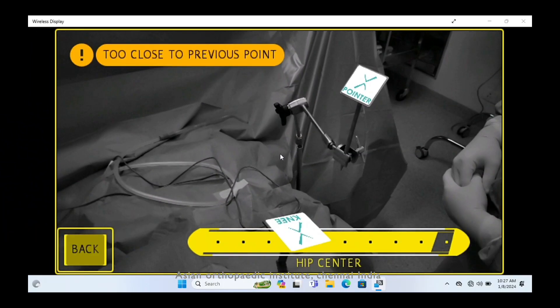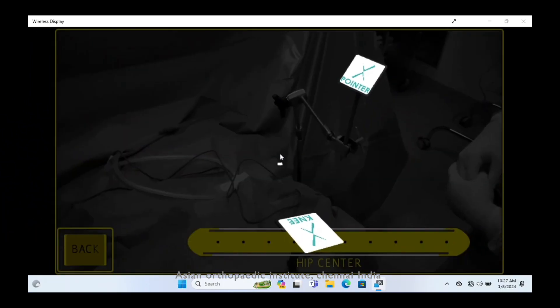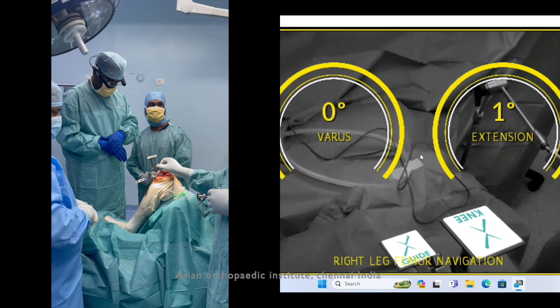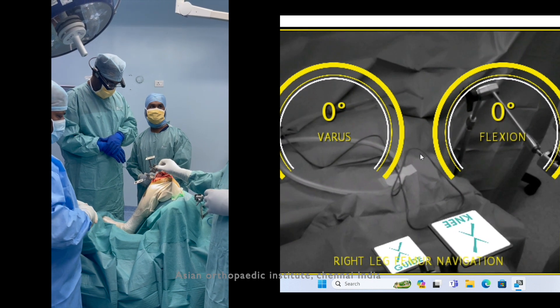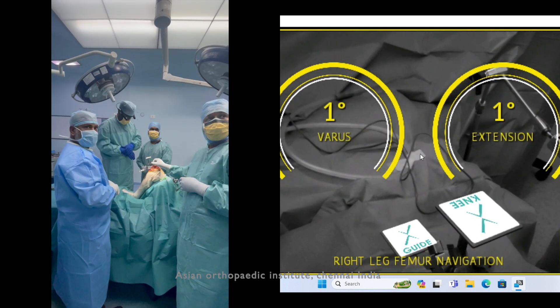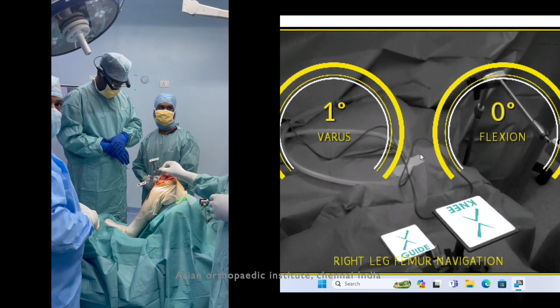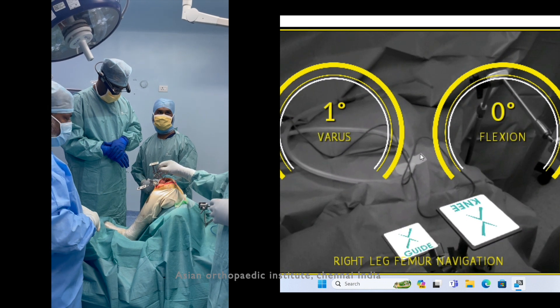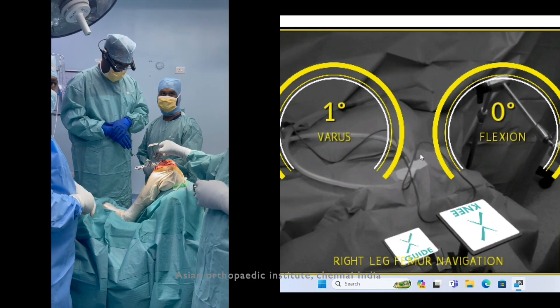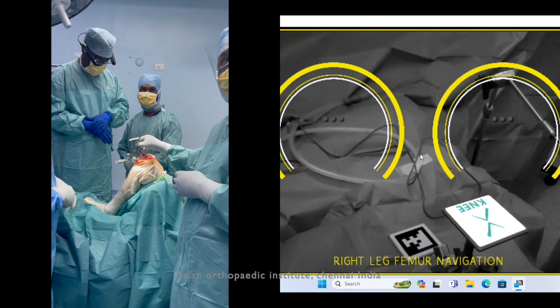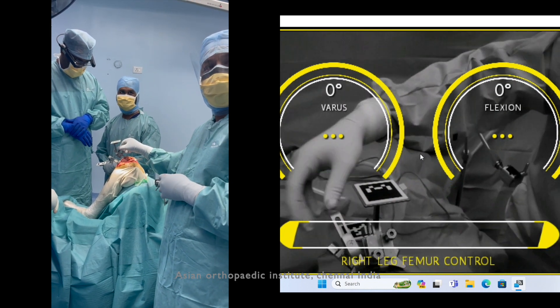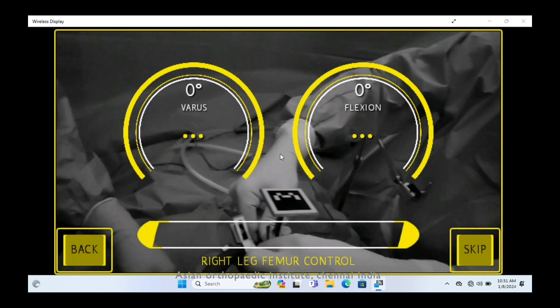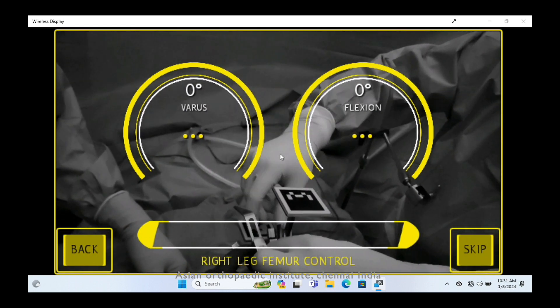Based on the hip center, there is a femoral entry point. Both the pointer and the knee center are used to take the long axis. Use the cutting guide on the femur — you can adjust varus/valgus and flexion/extension.